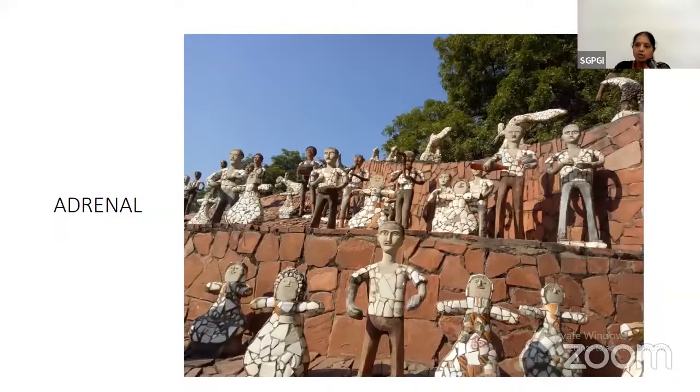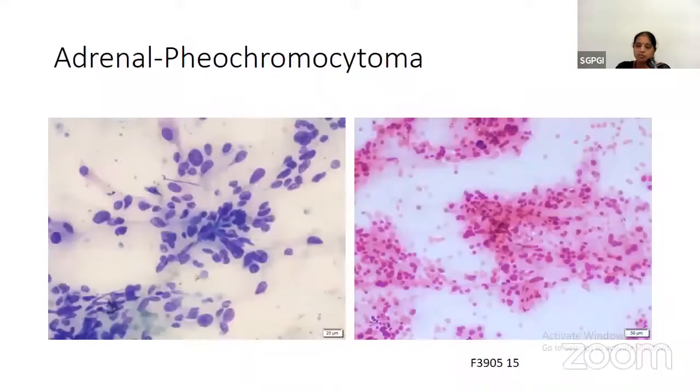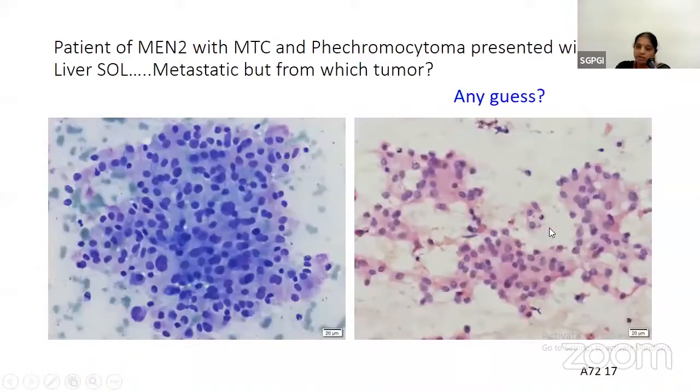So with this, we move on to a couple of adrenal lesions. Again, this is, like I said, just to complete the topic assigned to me. In a case of adrenal pheo, normally you don't want to put a needle if it's a proven pheochromocytoma, but sometimes the radiology and the clinical picture can be equivocal, and you can get these aspirates. You have this typical dispersed population or loose aggregates, some perivascular arrangement, syncytial kind of arrangement, abundant cytoplasmic granulation. So this was a straightforward case.